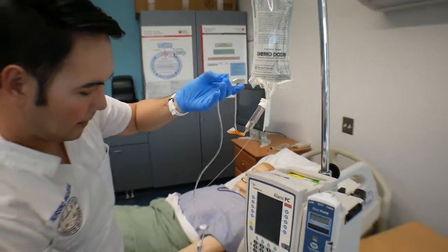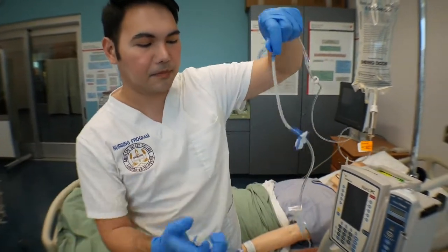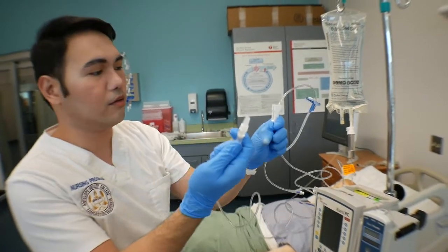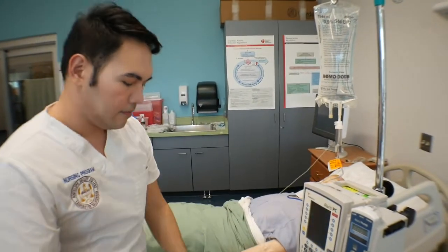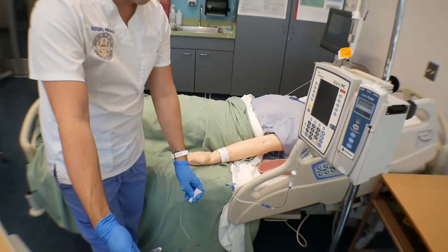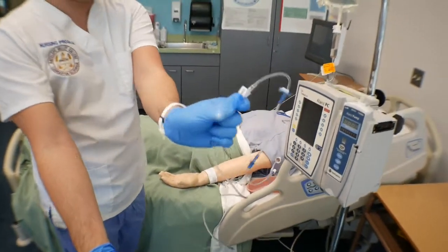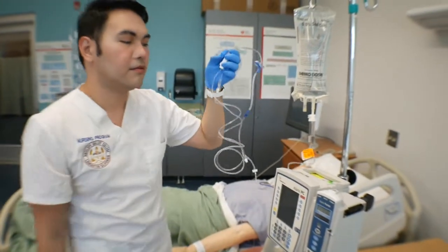And we'll go ahead and prime it. So for priming, you just need to unclamp this part. You can leave this with the cap, or you can loosen it up a bit so the solution actually flows. So we're gonna see if it flows. So it's flowing good. So I didn't need to take it out. Priming is just to make sure that there's no air in the line. There's no bubbles in the line. So once you see that there's no air in the line, you can go ahead and clamp it again. And your primary bag is ready to infuse.